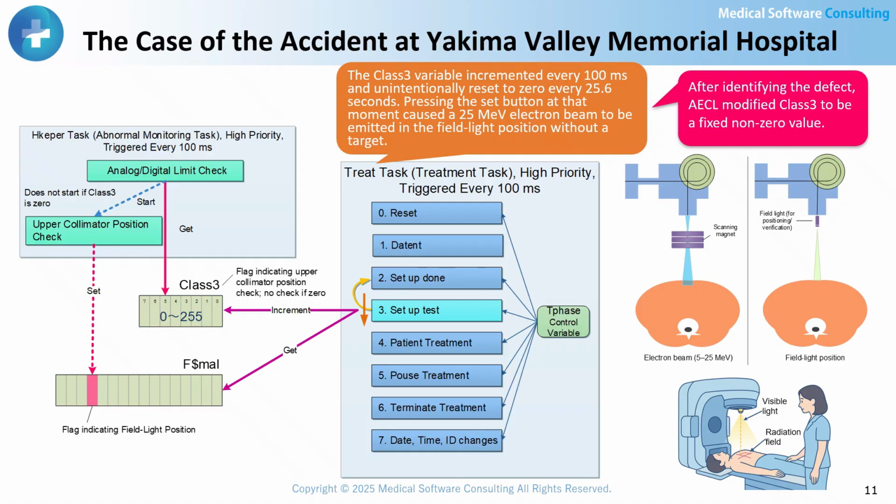Once identified, many software flaws seem like simple mistakes that invite the question, why was it ever designed that way? But tracing the root cause of accidents back to software is extremely difficult, precisely because software is invisible. This underscores the importance of maintaining documentation that explains the design intent, the software structure, how diagnosis and treatment are implemented, and what risk controls are in place. It also illustrates why the FDA, in its most recent pre-market guidance, now requires the submission of system and software architecture diagrams.